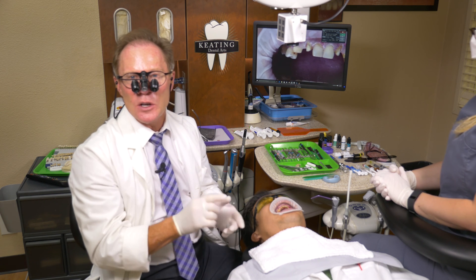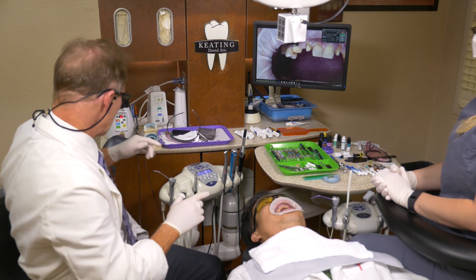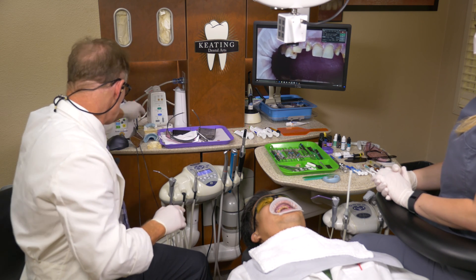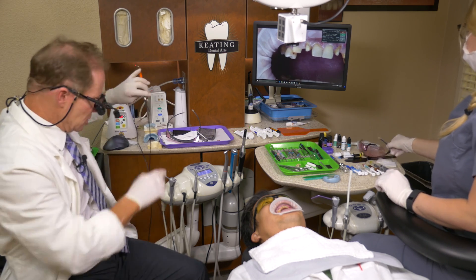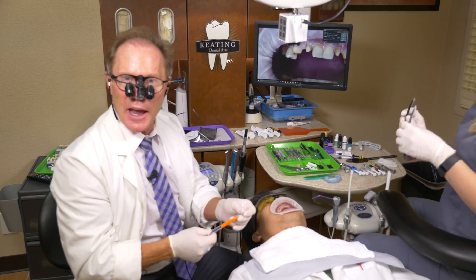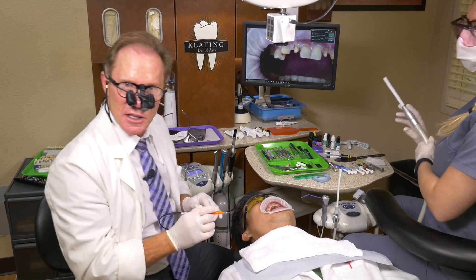To create this site, we're actually going to use a diode laser — we're going to use a Picasso Light diode laser. The Picasso is a soft tissue cutting laser made by AMD Lasers. Excellent device for this.